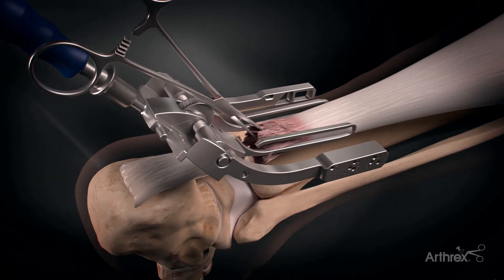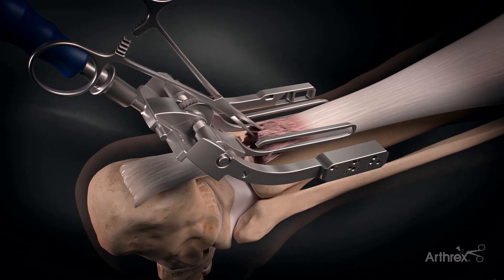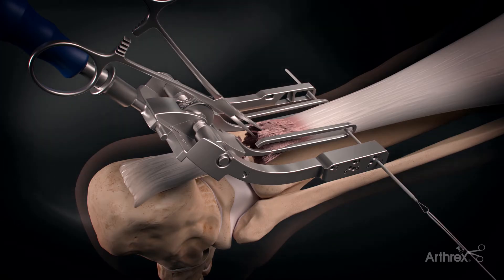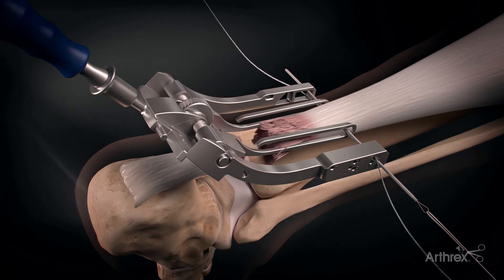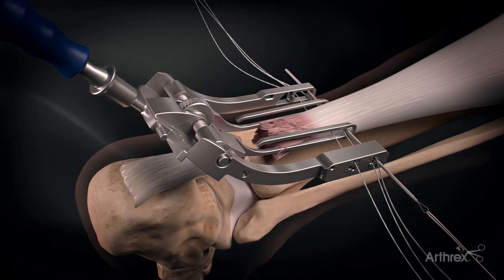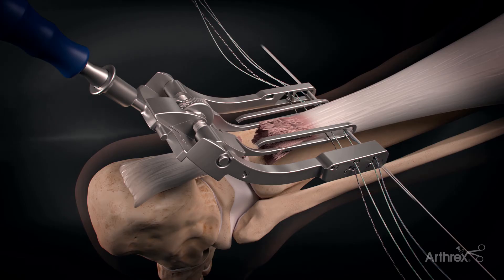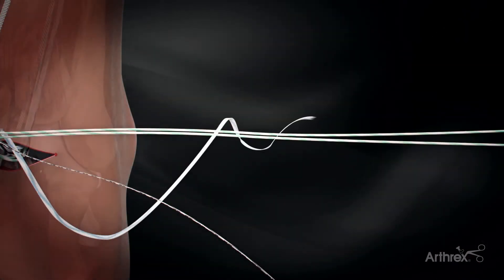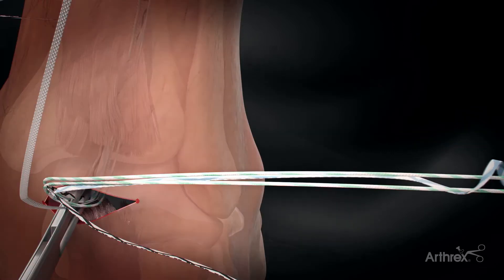The device you see here is called the percutaneous Achilles repair system, as it's a device that traverses underneath the skin to capture the Achilles. As you see these needles pass, you can see the sequential sutures are all passed to capture the proximal stump of the Achilles. This prevents us from making that large incision of a typical Achilles incision repair.